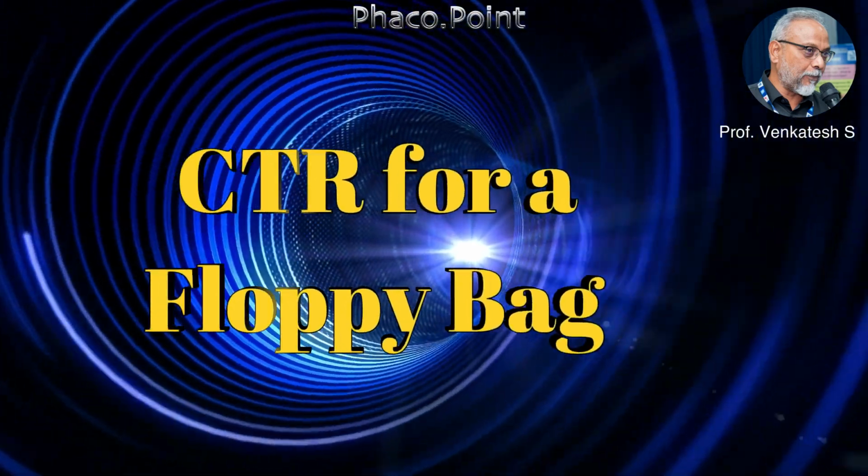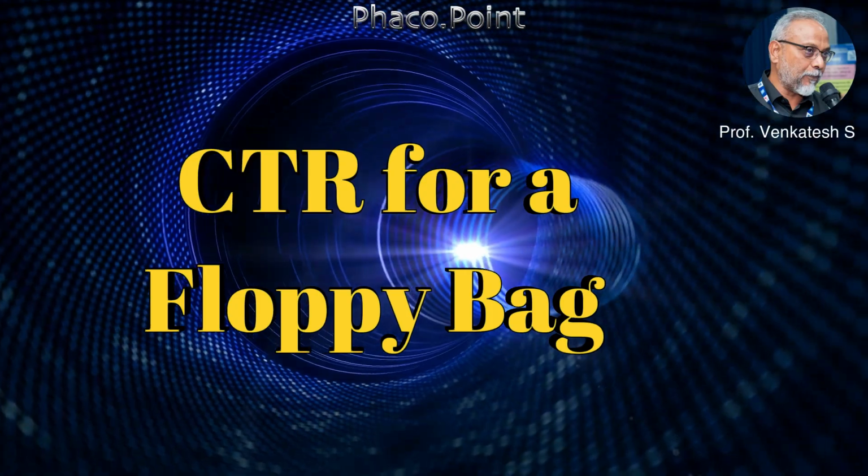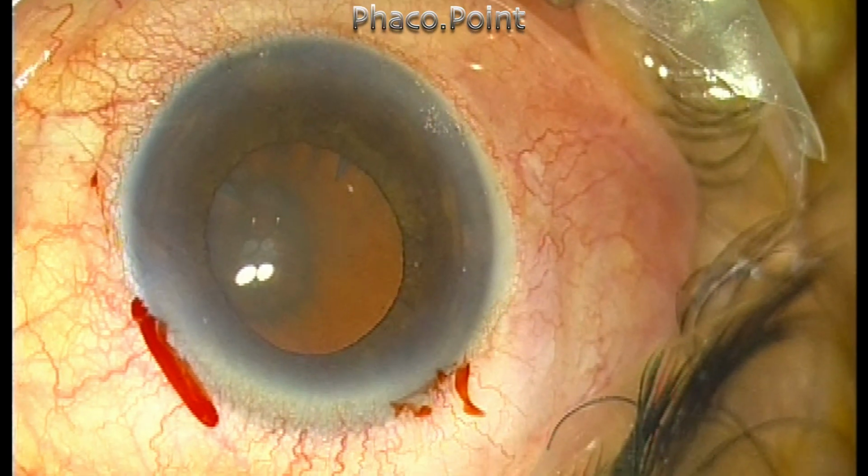Hello my dear friends, in this video I'm going to highlight an uncommon situation in which a CTR can be used. I'm also going to try to explain to you how a CTR should be implanted by the hand-to-hand technique into the eye. This patient had a non-dilating pupil and a grade 3 to 4 nucleosclerotic cataract. So I'm not going to show you the phaco portion.